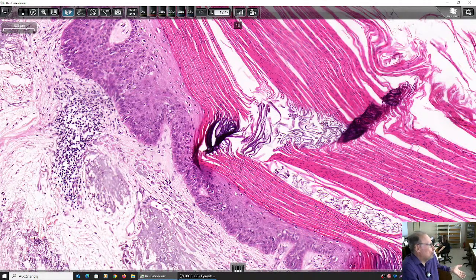Under normal circumstances, there would be one layer of cells close to the basement membrane because they give rise to the keratinocytes, which, as they go upwards, acquire cytoplasm and mature. In this case, maturation is not enough because we see an extension of basal cell-like cells which, being primitive, have not enough cytoplasm, so that's why they appear dark in hematoxylin eosin.